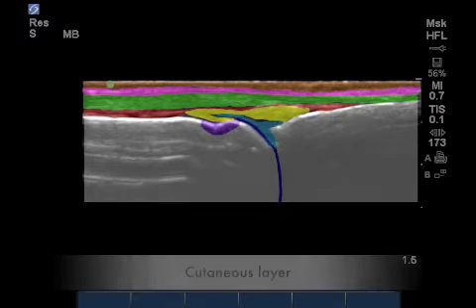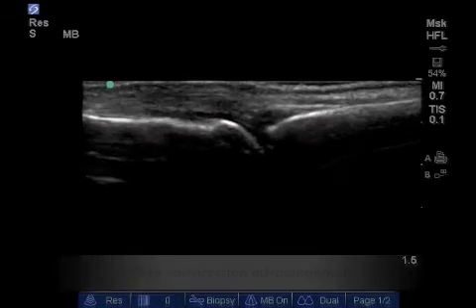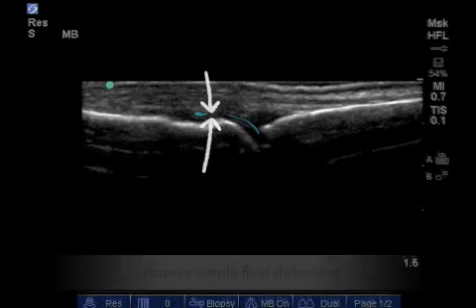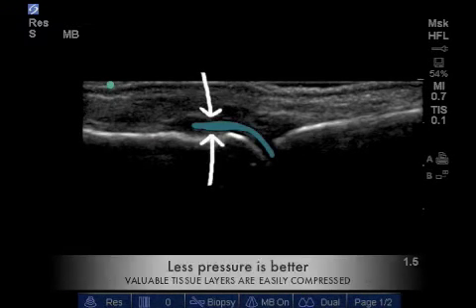In this video clip, I will demonstrate the sensitivity to probe pressure on the synovial capsule. Observe the simple fluid displacing while the transducer is depressed. Upon letting up on the probe pressure, we see the simple fluid emerging from the joint, highlighted here.